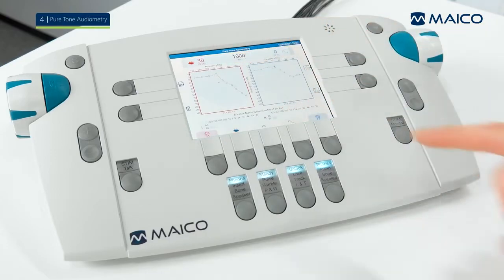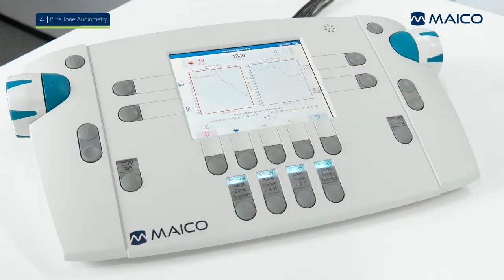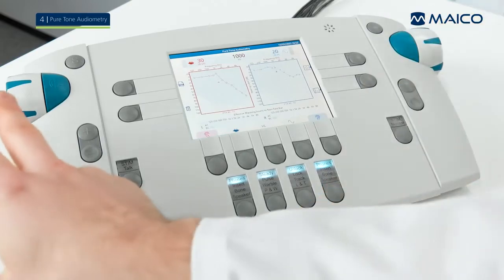Graphical display of the stored results appears in the 1 or 2 audiogram view. The cursors show the selected levels. The test signal is represented by a plus, the masking noise is indicated by a minus symbol.